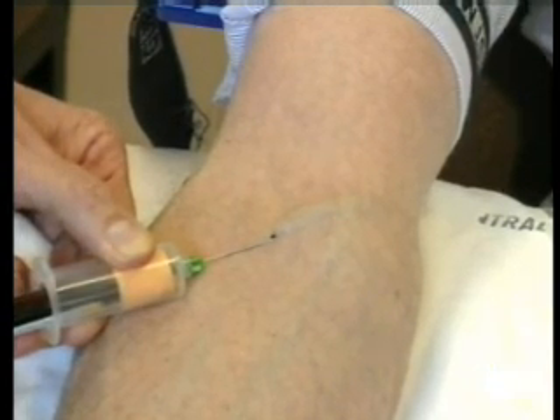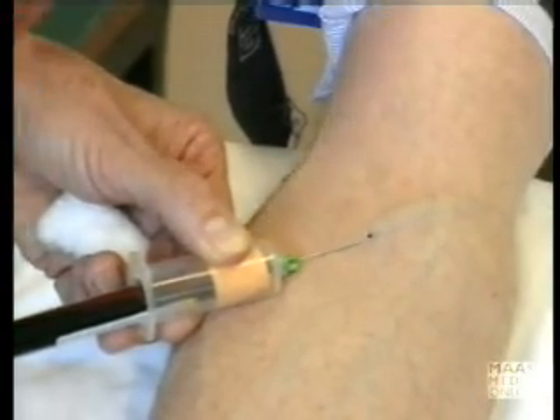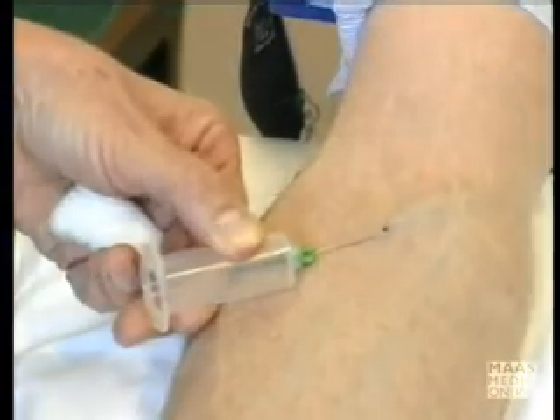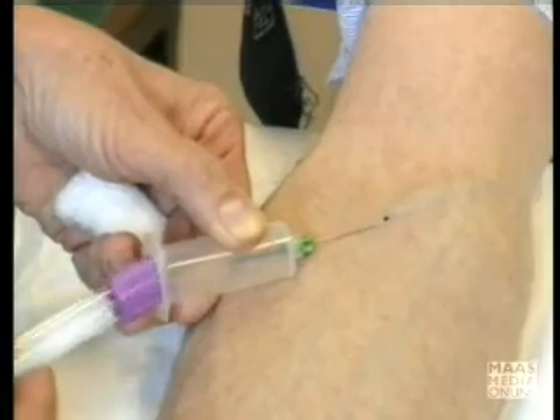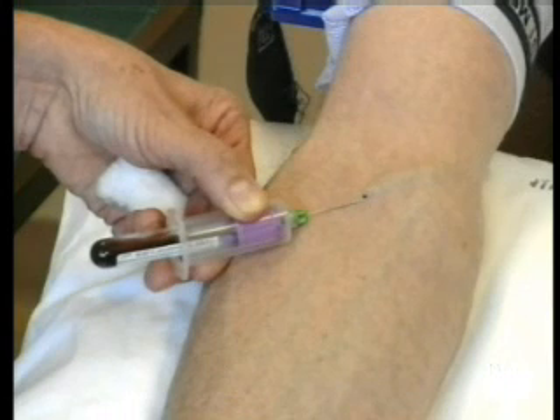You'll see that blood is flowing up into the tube, and when it is full, you take it off, but you keep the needle holder anchored to the skin the whole time. Push the next tube on, and up it goes.